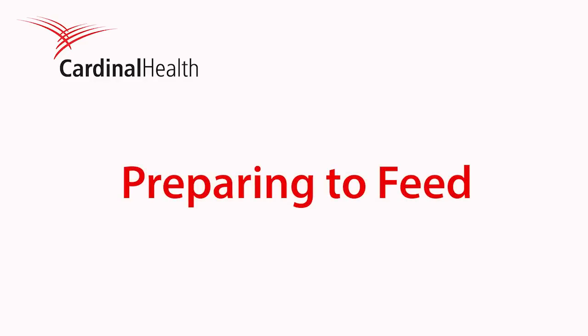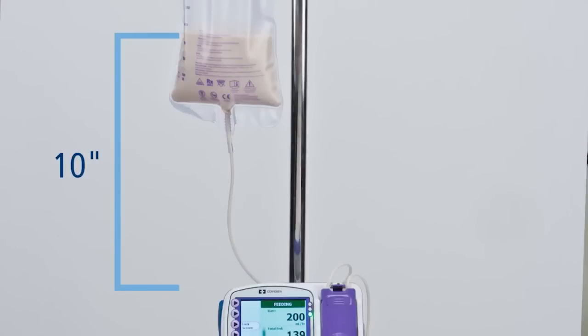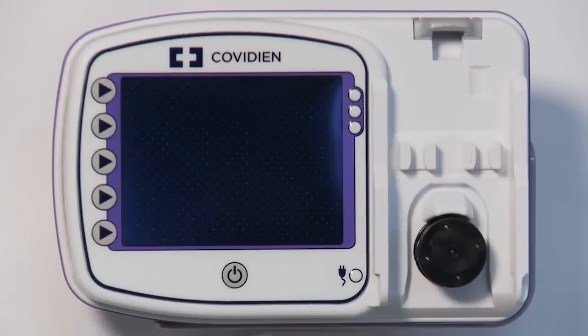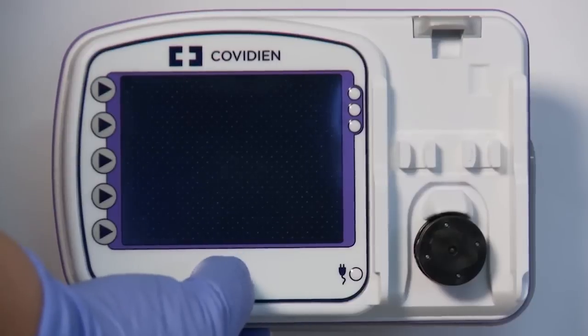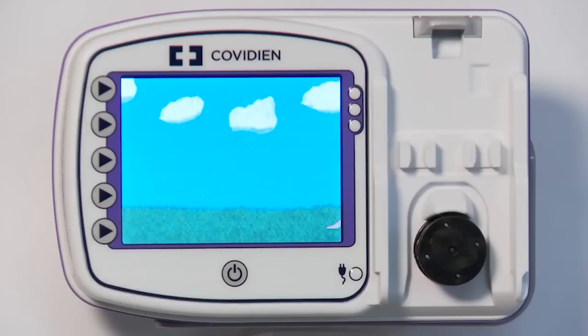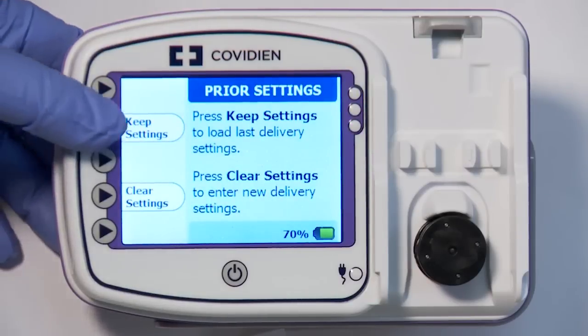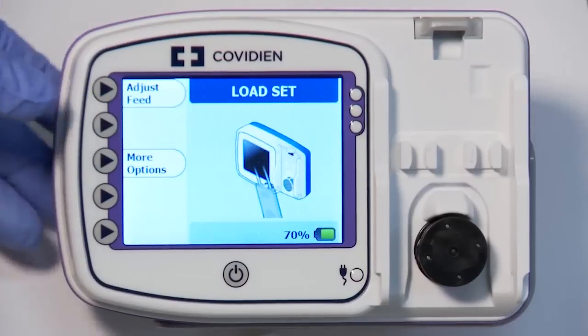Preparing to feed: hang the prepared feeding set bag or fluid container so the starting volume of fluid is 10 inches above the top of the pump as shown. Press the power button centered below the pump screen to power up the pump. If you have used the pump previously, your last settings were automatically retained for you. Press Keep Settings to keep the settings from the last feeding, otherwise press Clear Settings.